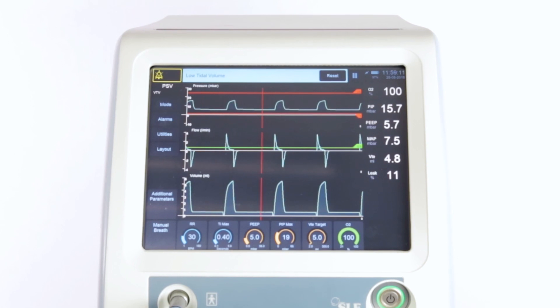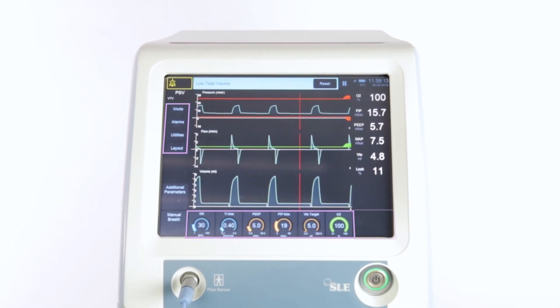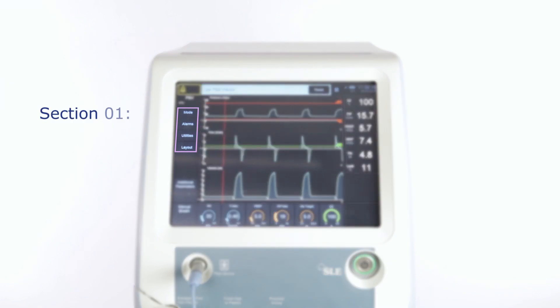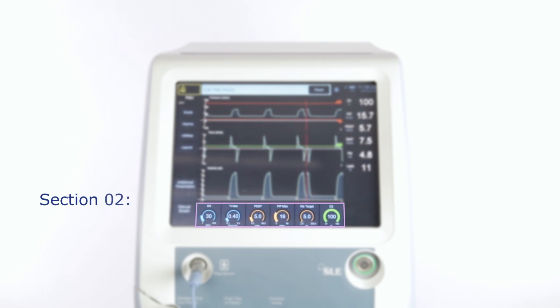The ventilator screen can be divided into six main areas, each with a distinct purpose. Section 1: Down the left hand side is for the main controls. Section 2: Along the bottom of the screen are the primary parameter settings, which will change depending upon the selected mode. Section 3: A blank area where adjustment and confirm controls appear when needed.